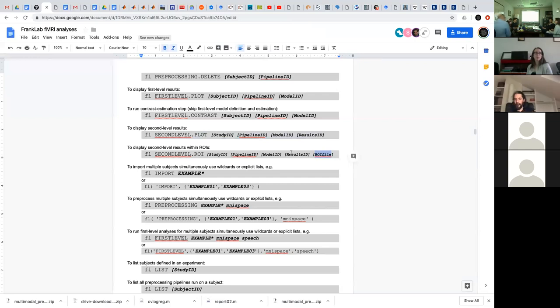So we need to, yeah. I'm worried that, for instance, we have this new DTI-based parcellation of the thalamus, for whatever it's worth. But that would be individual ROIs for each subject. Yep.